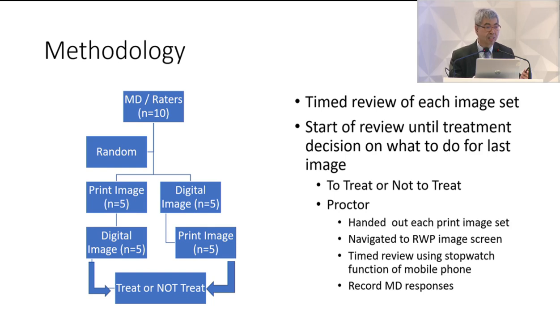We gathered 10 trained retina specialists, and we had them review image sets. Half of them reviewed print images first, followed by digital images, and the other half, digital followed by print. Based on the last image of each image set, the doctors would have to make a decision whether to treat or not to treat. And we timed how long it took the doctor to review the image until the time they made a decision whether to treat or not to treat.